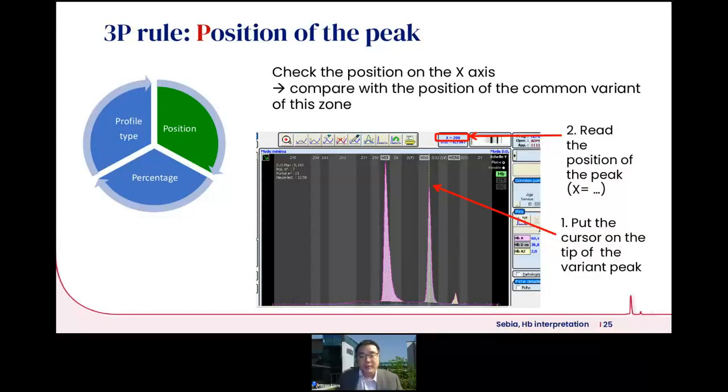So next would be the position of the peak, the variant peak that's being formed. In the capillary electrophoresis software, if you were to place your cursor at the peak, it will indicate for you exactly the position of the peak, which is also a signature aspect of the variant to help you identify the variant accurately.